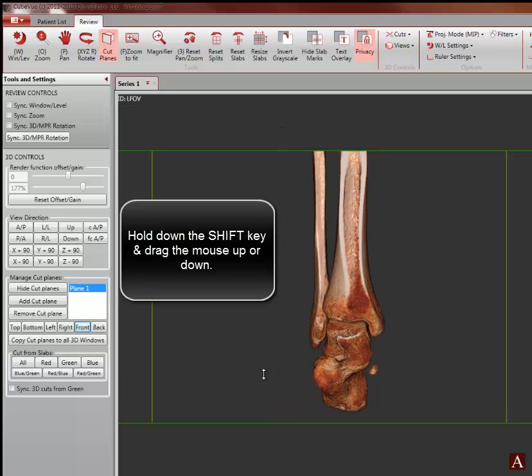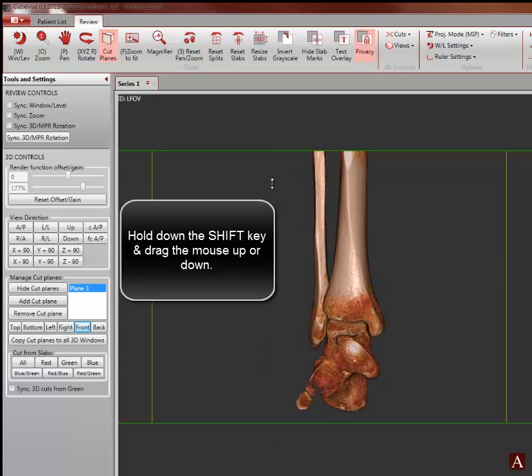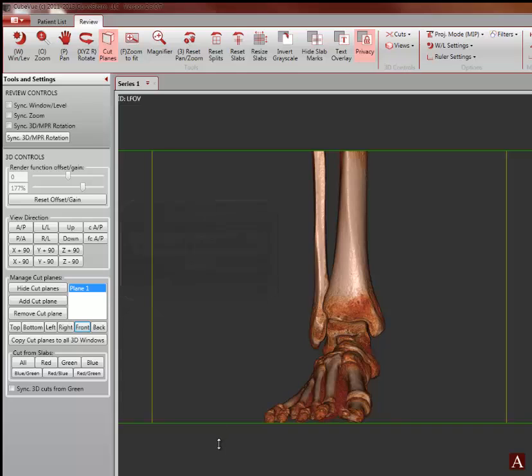Now, to peel away or add anatomy, first hold down the shift key, then drag the mouse up to peel away or down to add.